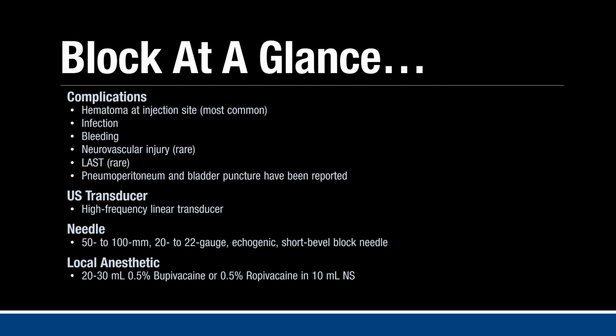However, the distance at which the skin is punctured from the neurovascular bundle minimizes the risk of neurovascular injury. Furthermore, fascial plane blocks are lower risk as the target injection site is relatively distant from the femoral nerve and vessels. Last is the most feared and devastating complication that we worry about, though it's rare if dosing recommendations and proper ultrasound-guided nerve block performance technique is followed.